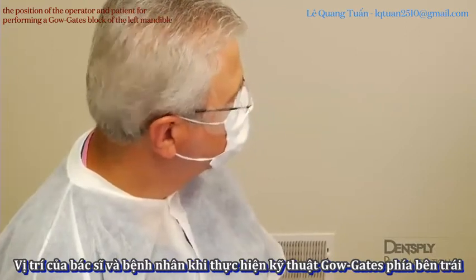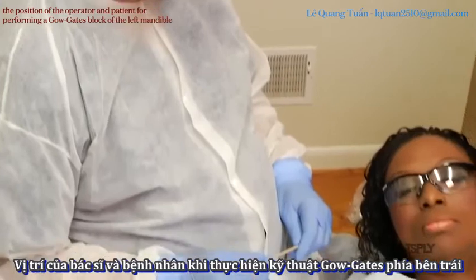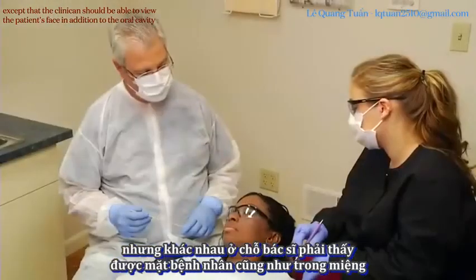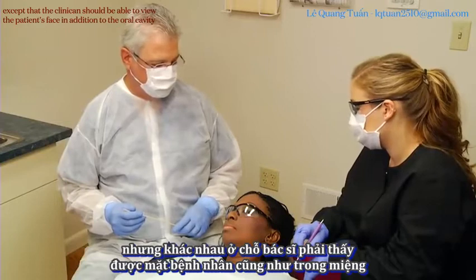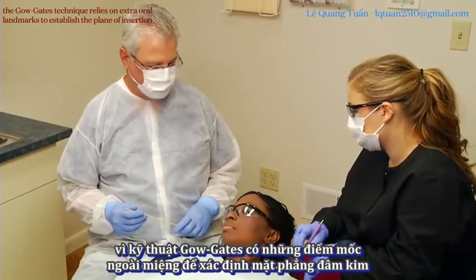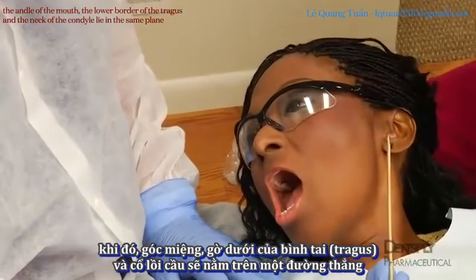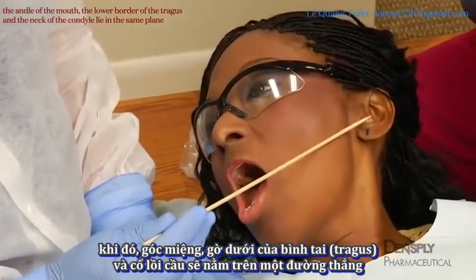The position of the operator and patient for performing a Gow-Gates block of the left mandible is similar to that used for the standard inferior alveolar nerve block, except that the clinician must be able to view the patient's face, in addition to the oral cavity. The Gow-Gates technique relies on extraoral landmarks to establish the plane of insertion. With the mouth wide open, the angles of the mouth, the lower border of the tragus, and the neck of the condyle lie in the same plane.